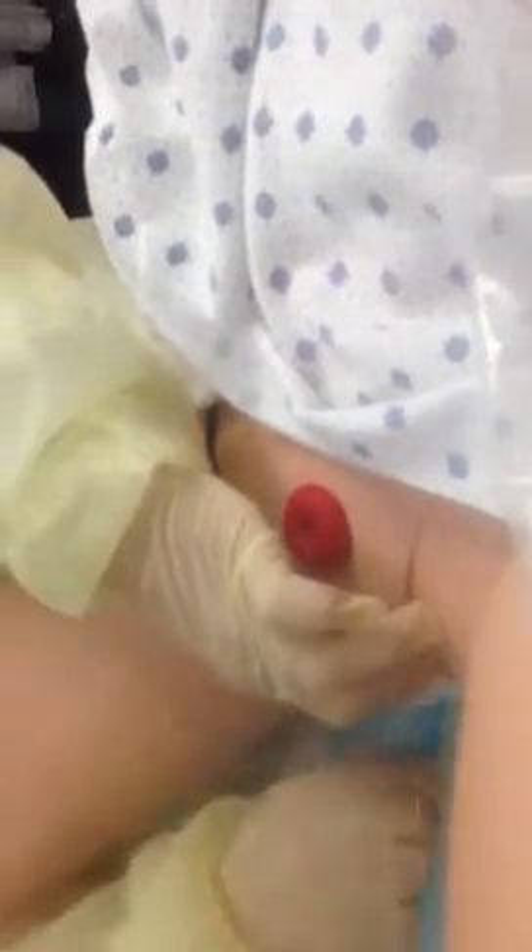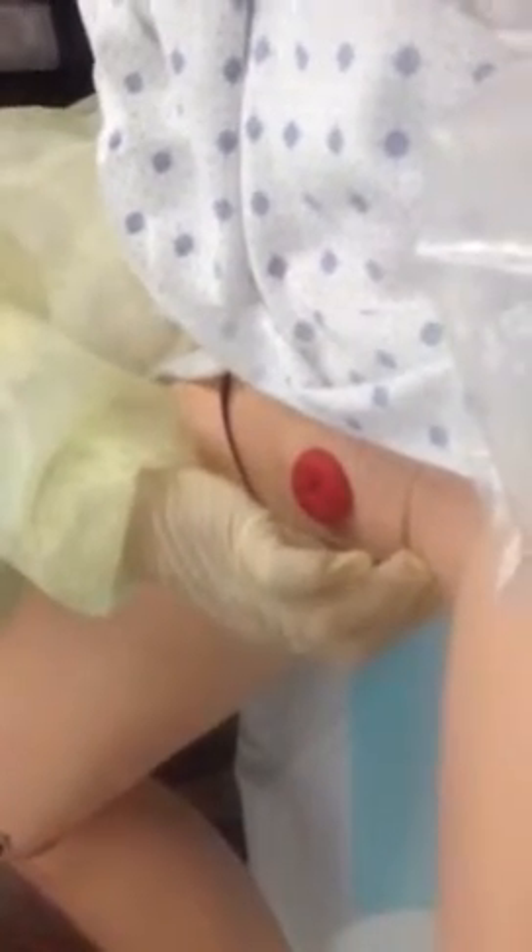You take another one, go down the middle, and you can go down as far as you want. It's important to keep it clean. It's not going to be sterile per se. Go down the middle, and with this last one you're going to drop everything in there. Where students forget is they put the tweezers back in their kit, and you can't do that. So you can gently pick up that and do that, but once you're done cleaning, into the bag it goes.